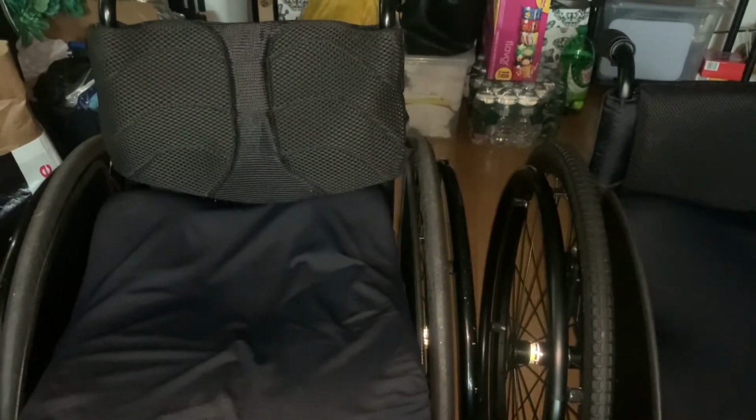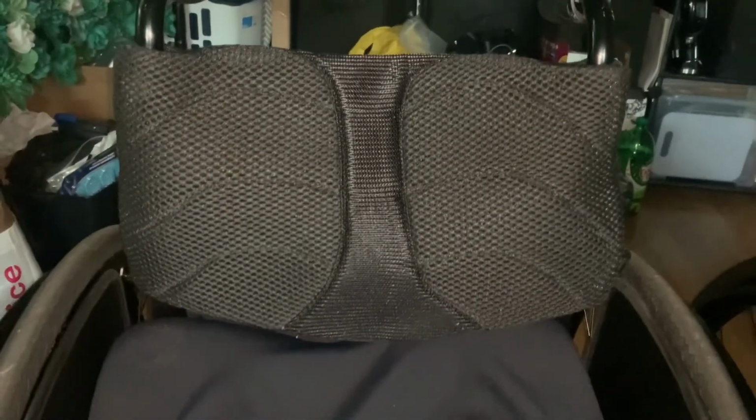All right, so here's a side by side of my old chair and my new chair, and as you can see, there's a big difference in the sizing. Obviously, you can see what I was telling you guys about the back of the chairs. The backings are different. This one is not small but shorter, and I have to get used to it. It's square, as opposed to my regular chair that I'm used to, which has a little more back support, kind of oval shaped, and it is a little higher just by a tad bit. Not much of a big difference, but I just wanted to show you guys.